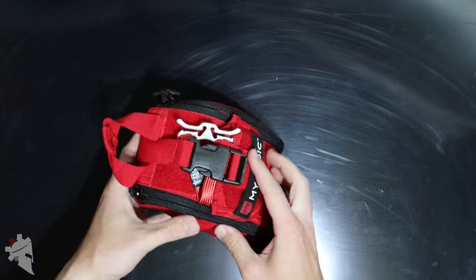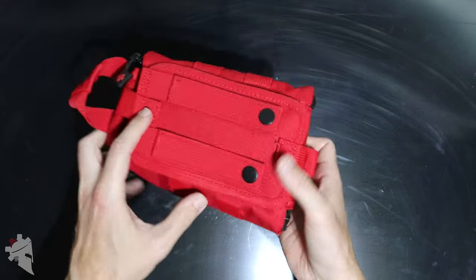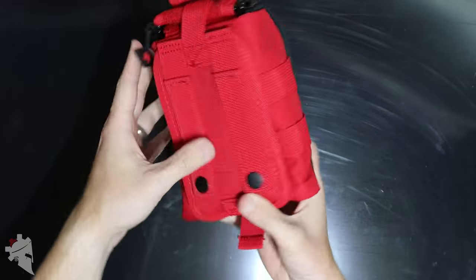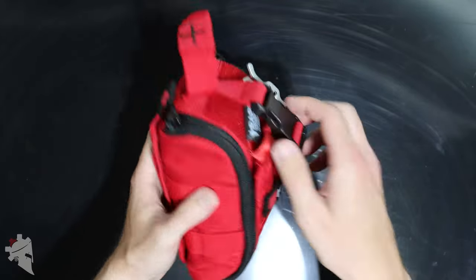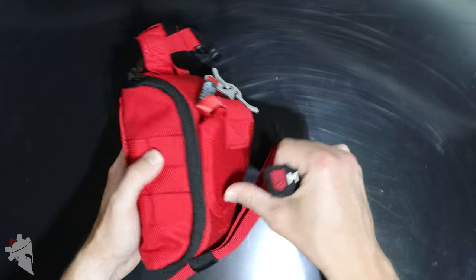This main buckle is a strap that goes all the way around and is actually attached to the velcro panel on the back. The two MOLLE straps allow it to be attached to a bag, a plate carrier, etc. Nice rubberized patch there on the front.